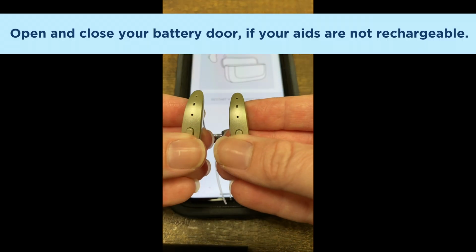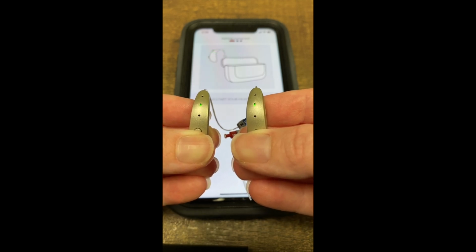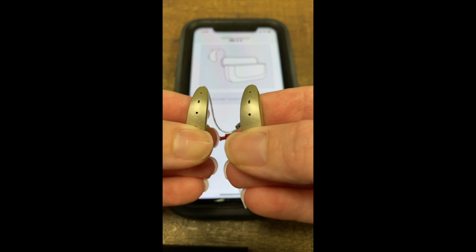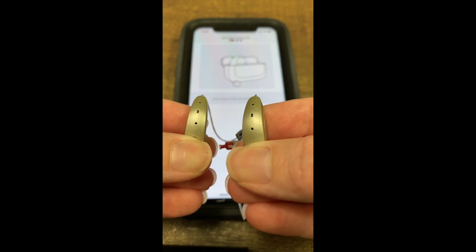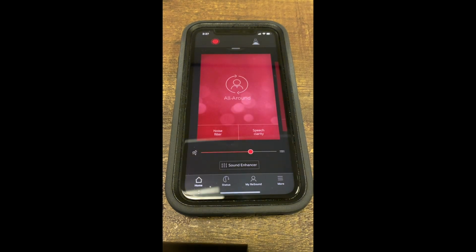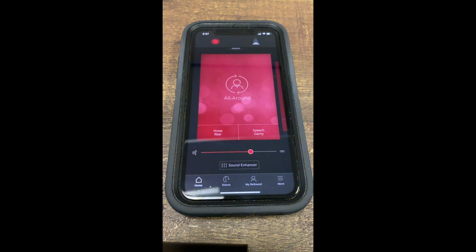So once again, you want to hold those buttons down until you see the 3 green flashes. Then you can let go. And then you'll want to press and hold those buttons again until you see the single flash. That means they're on. Now if you'll just hit continue at the bottom, and now your hearing aids are paired to the app. If it gives you any prompts, you can go ahead and accept or deny those as you wish.